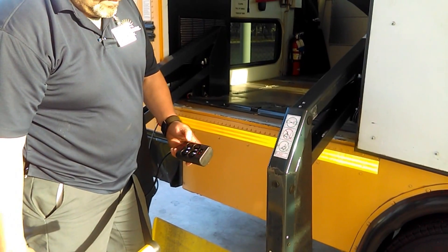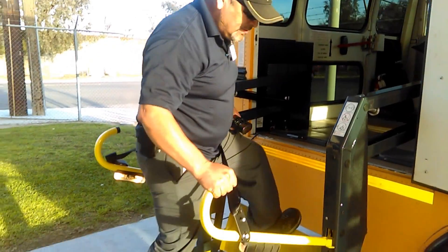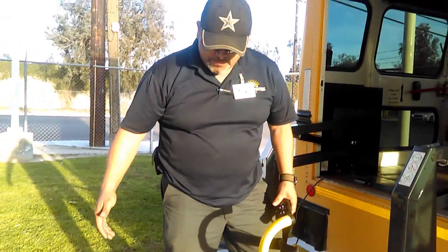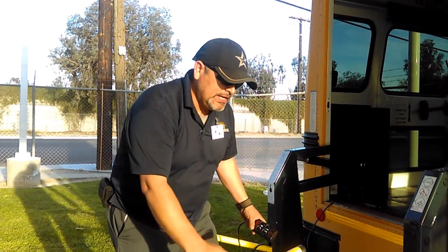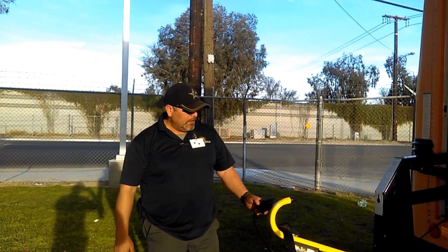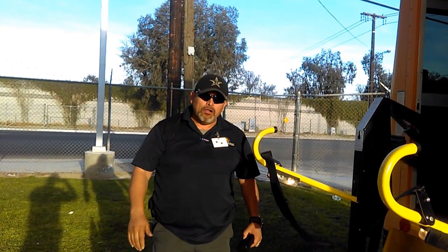Now I'm going to lift it up about 12 inches and check the safety flaps — also the one in the back. The purpose of the safety flaps is to hold the wheelchair in place in case the wheelchair brakes are not operating properly. As I raise the lift, I'm checking again for no pulling, no jerking.